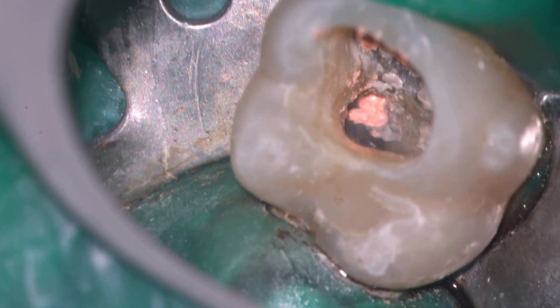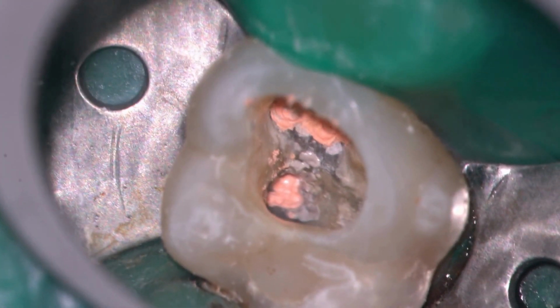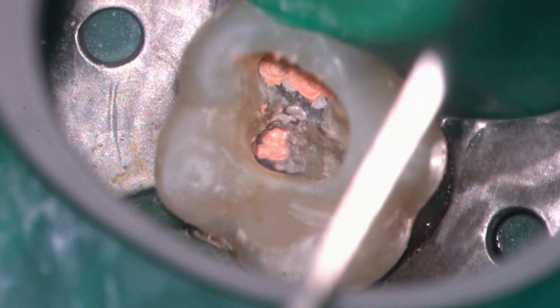I really think the best option for that larger and more coronal area of resorption is the Biodentine, because the strength properties of Biodentine are more favorable. Here we are with the DB canal system pretty much obturated and sealed to the level that I want it to be, and we're starting the cleanup process.